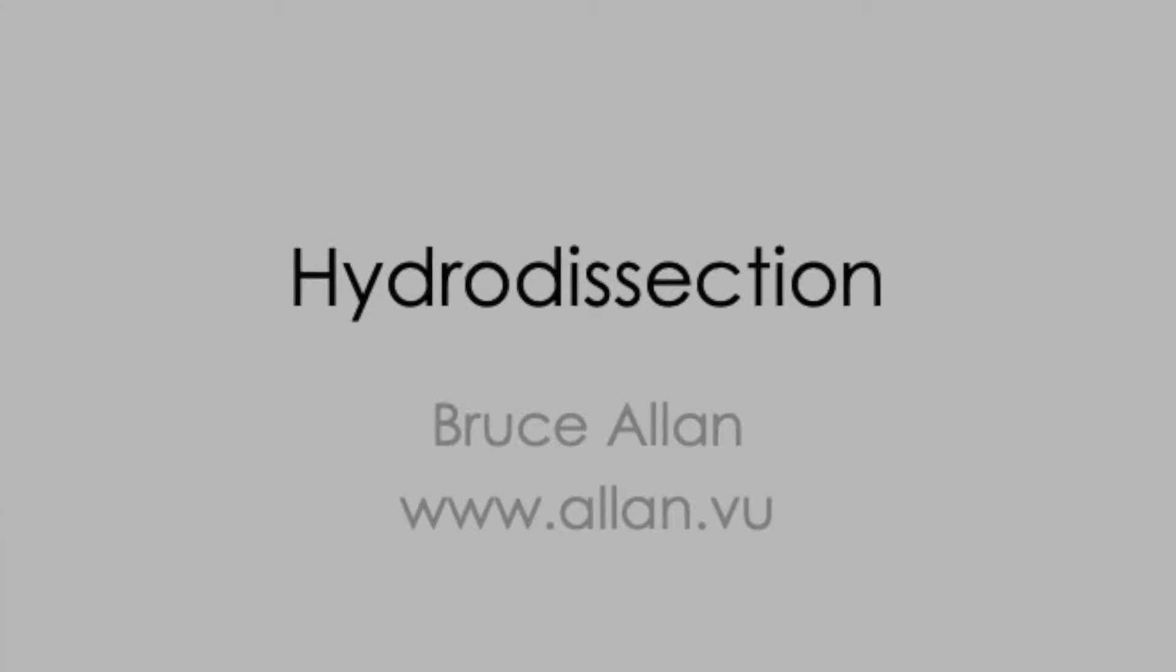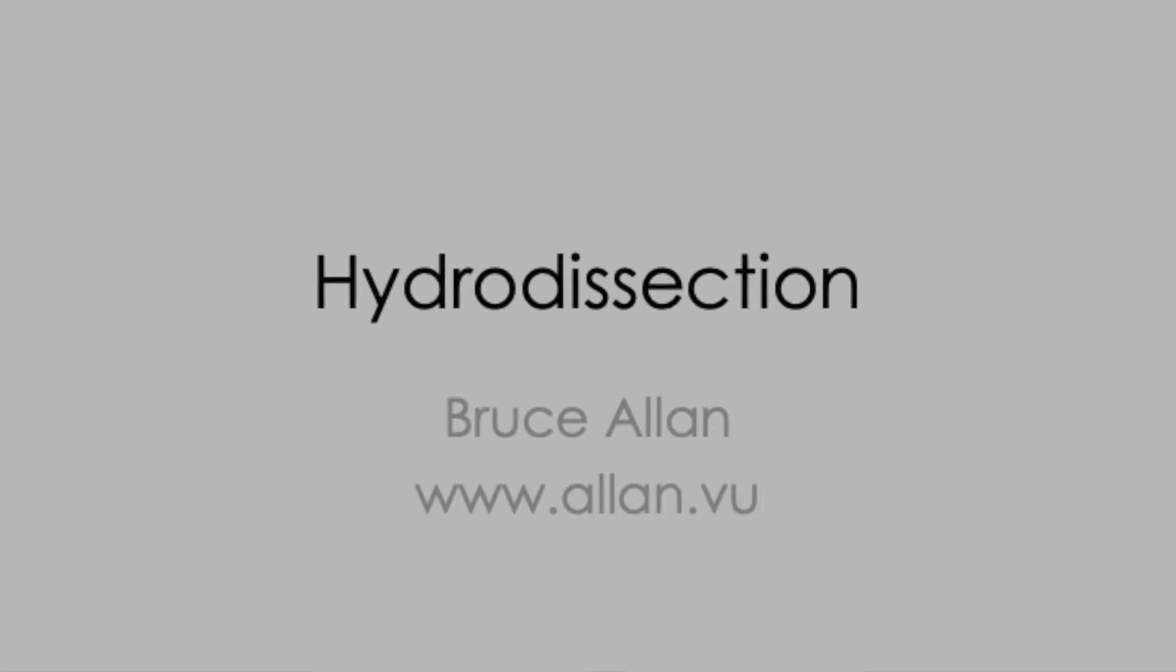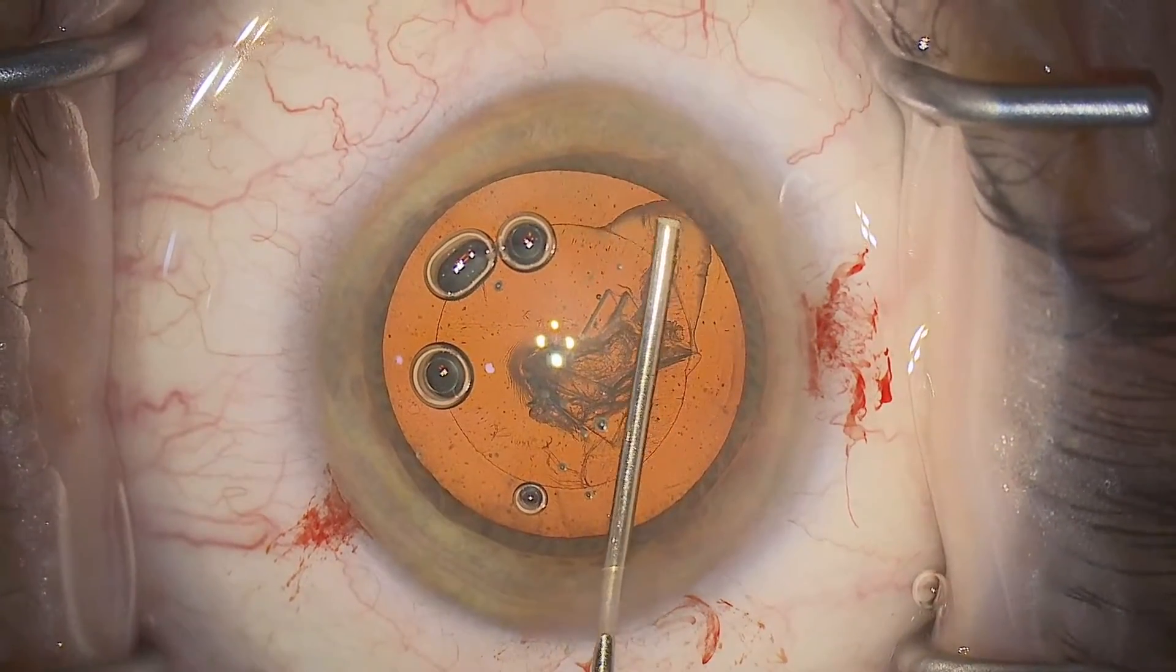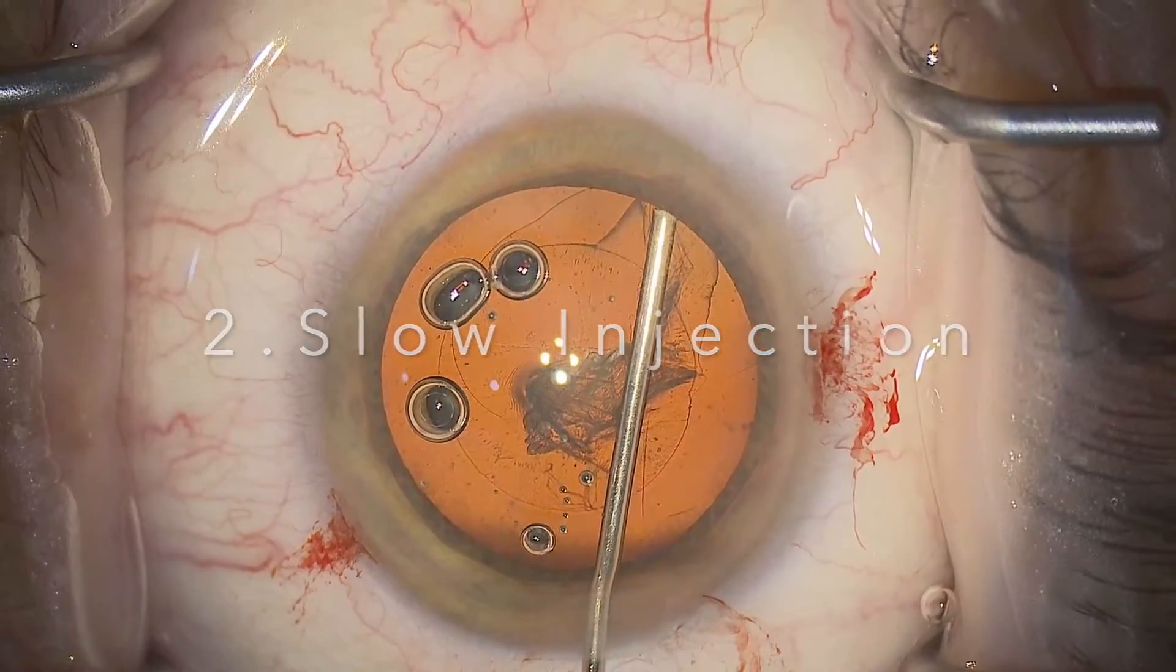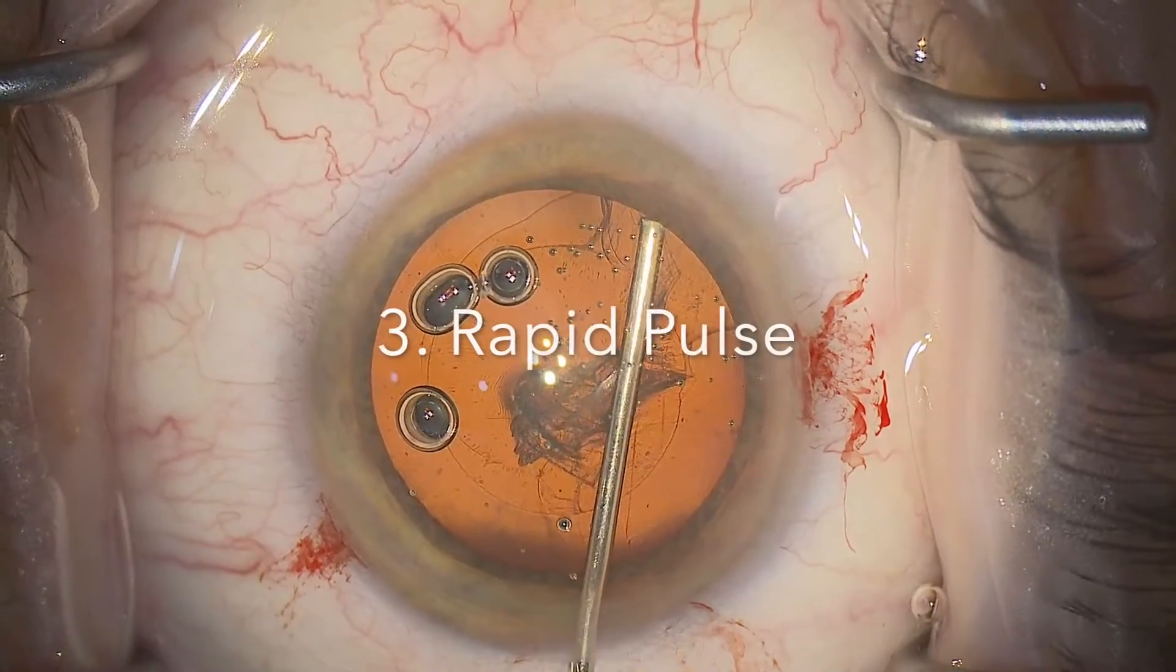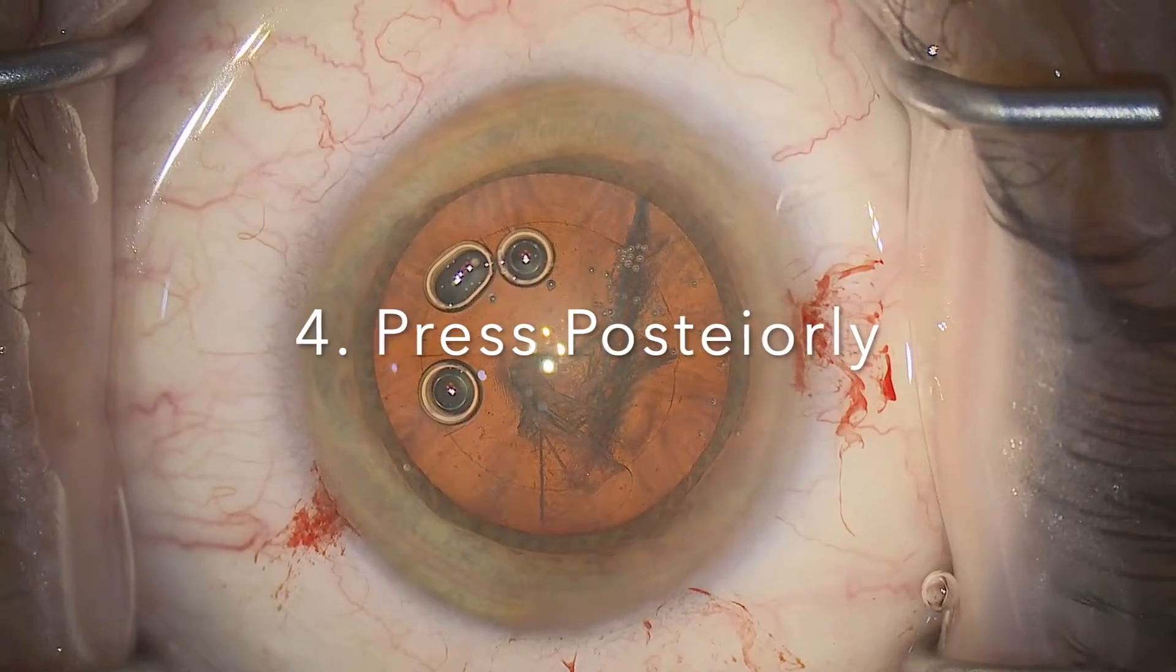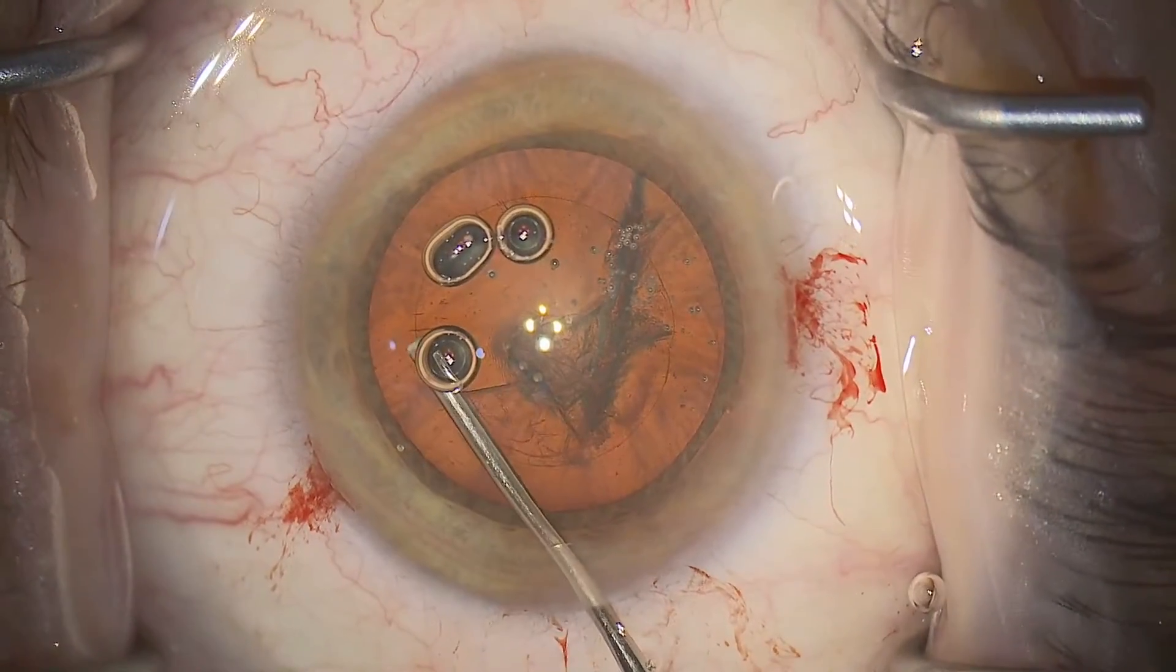Here we're going to talk about breaking hydrodissection down into four stages. These are: gentle lifting to establish a cortex cleaving hydrodissection plane, slow injection for free flow, rapid injection for the hydrodissection, and pressing down to neutralize the capsule block.